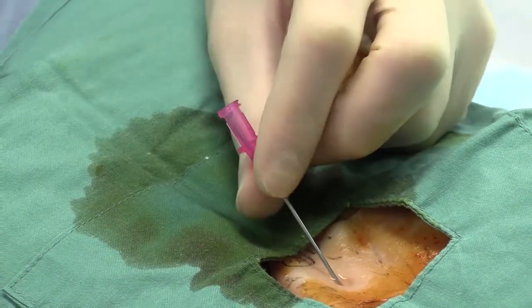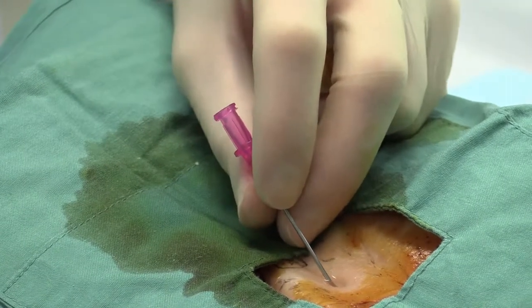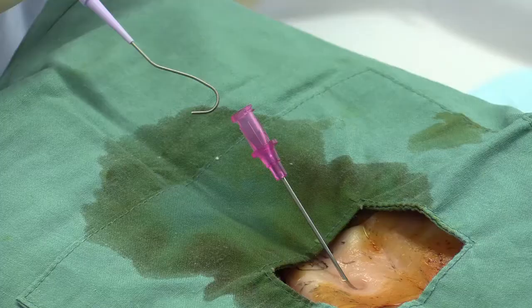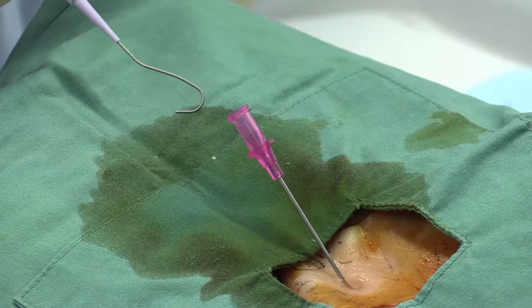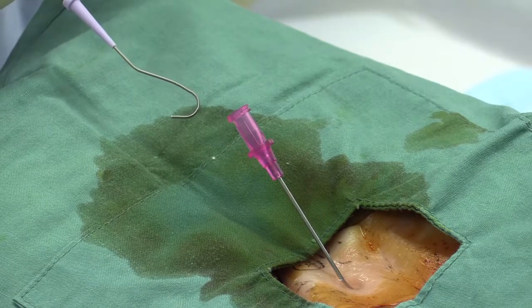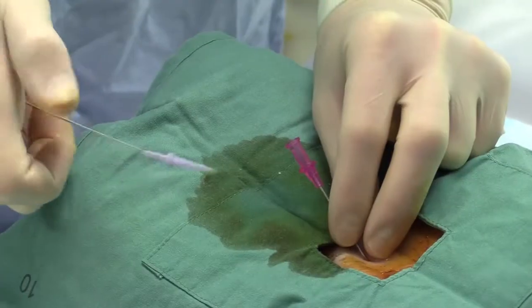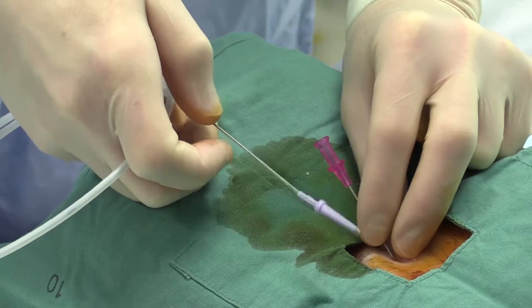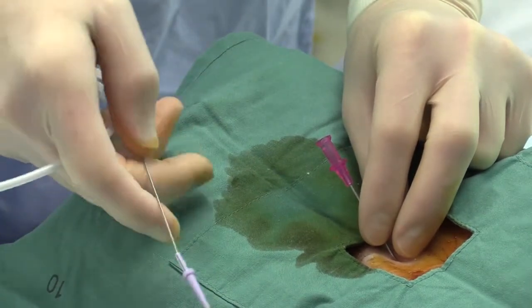Once your needle is in the correct position and securing it firmly with one's left hand, we introduce the guide wire. The purpose of the purple straightener is to straighten the shepherd's crook that is a design of the guide wire to prevent visceral perforation. So this is the position that I have the guide wire. The shepherd's crook is straightened, the guide wire being held in my right hand.